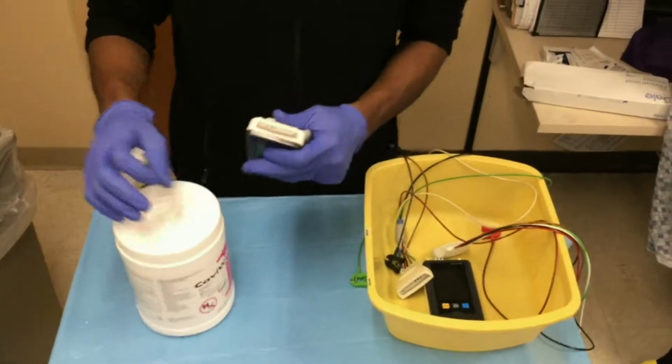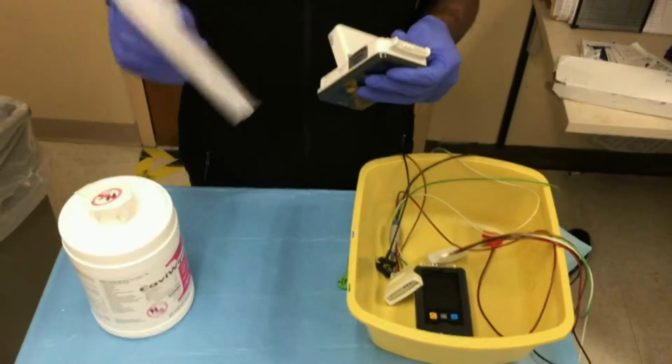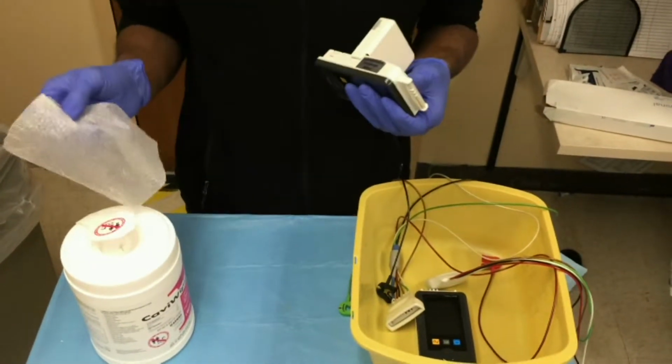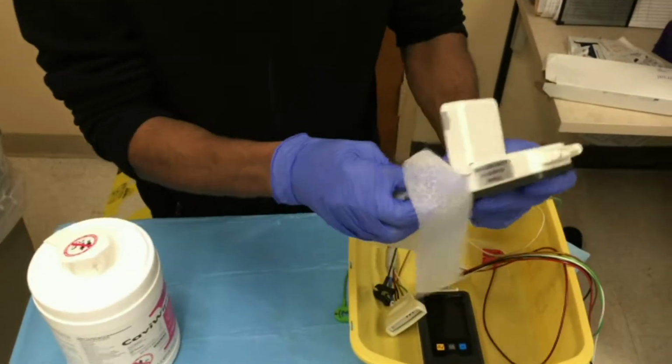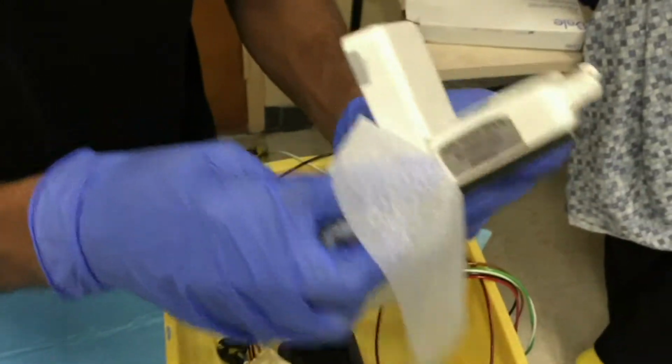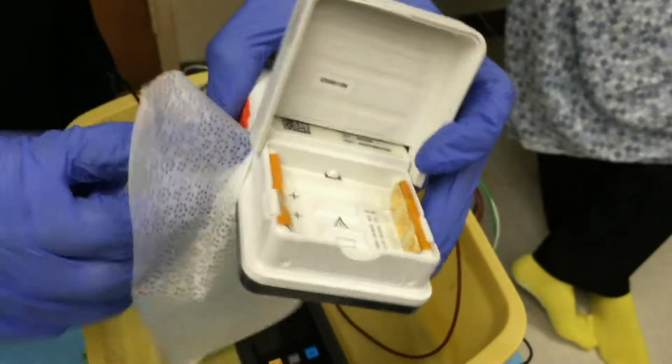This is a two-step process, which means you will use one Cavicide wipe, or as many as needed, to remove all residue, and then use another fresh Cavicide wipe to clean the monitor again. You want to make sure the batteries are removed first. Then clean the outer perimeter of the box.